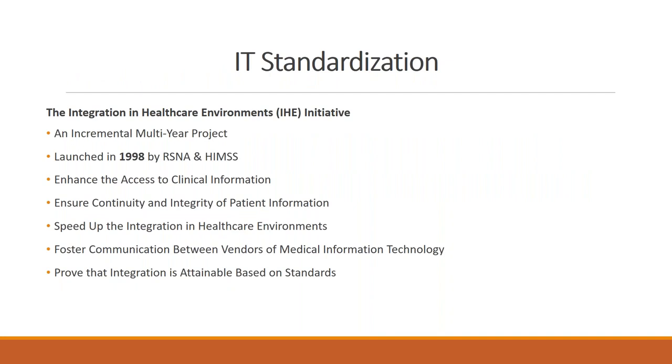IT standardization. When all this started to come about, it took until about 1998 when they launched the IHE, and that was an initiative to make sure that they try and standardize language across the whole environment. It was very challenging, as we talked about with DICOM launching, that images could not come across. Vendors were not using similar language across their own products and compared to other products as well. So this IHE made sure that we started talking in the same language, which allowed for successful integrations and interfacing. Think about trying to do a handshake electronically when none of the language matched up.